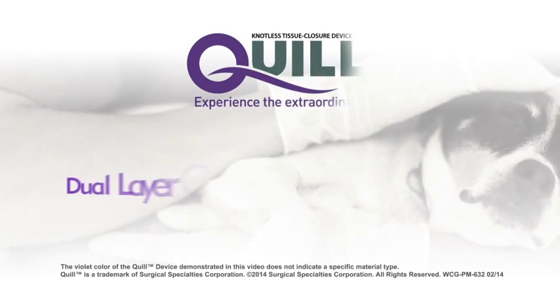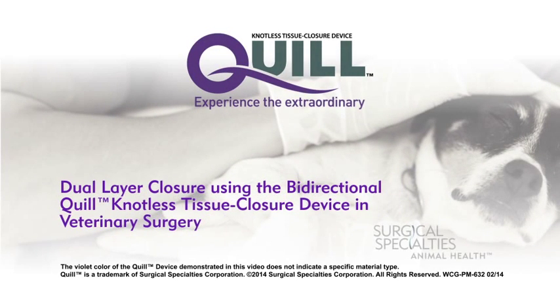The following video demonstrates a two-layer closure utilizing the Quill Bidirectional Knotless Tissue Closure Device.